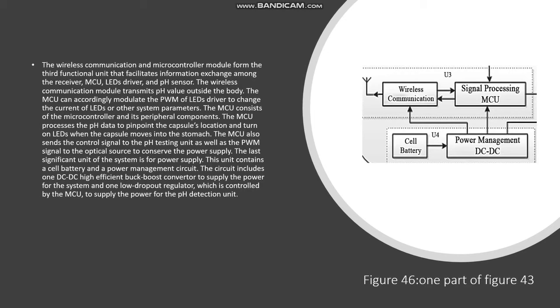The last significant unit of the system is for power supply. These units contain a cell battery and a power management circuit.